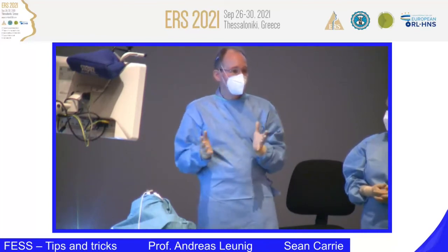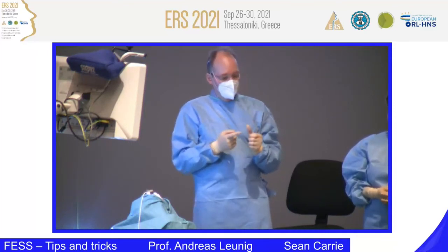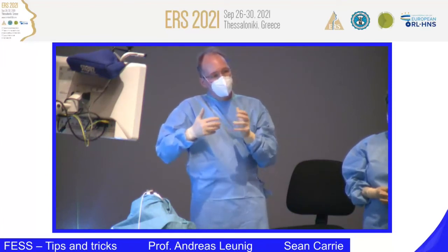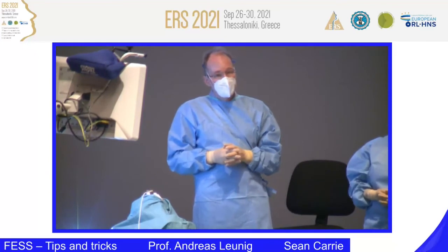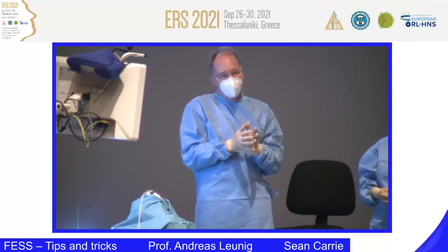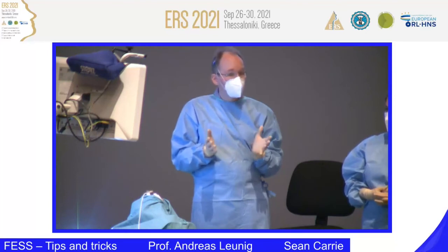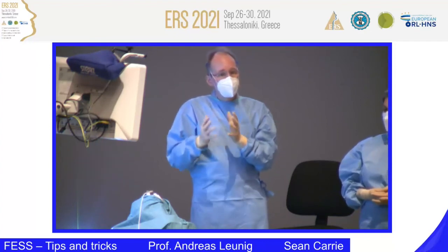But you have seen a complete fronto-sphenoethmoidectomy without harming the middle and the superior turbinate. You have seen a full endoscopic procedure and all the possibilities that this kind of technique provides with different instruments, food for thought. However, this has only to be done when the patient is really symptomatic, and you have to adapt and individualize your surgery. The beauty of FESS, and this is a statement by Heinz Stammberger, the beauty of FESS and the endoscope is that you can avoid extended surgery in many, many cases.